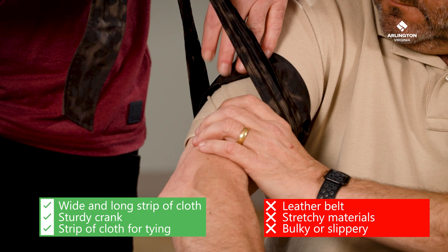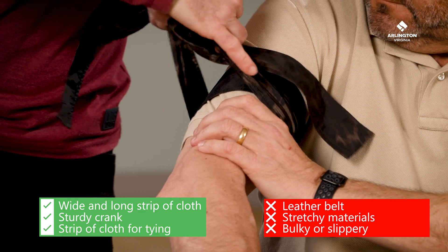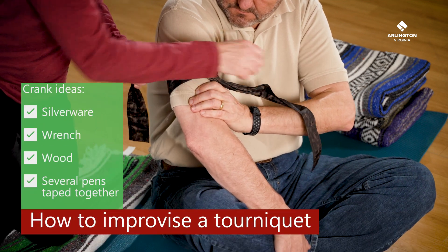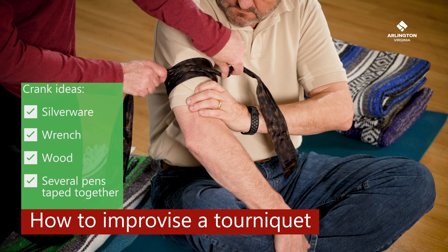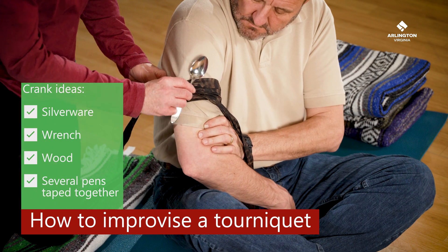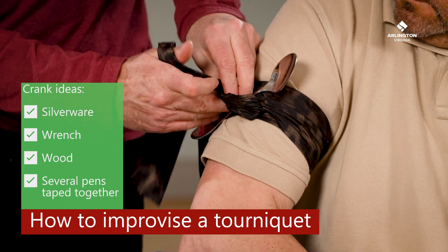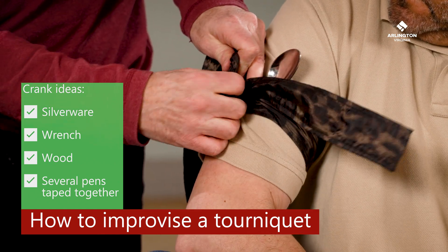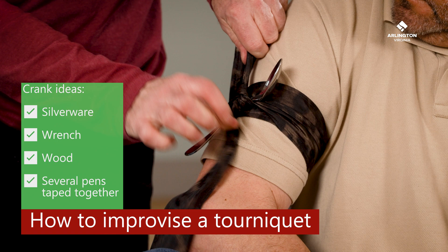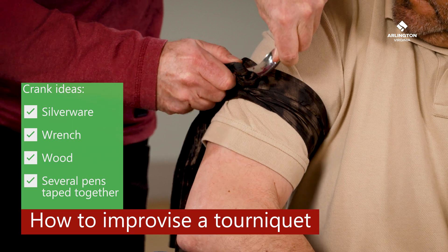People often want to use a leather belt, but it is not a good tourniquet strap because you can't twist it. Your strap will also be more effective if it's not too stretchy, bulky, or slippery. Start by draping the cloth from the top over the limb, then pull the ends around tightly and tie a knot — this creates a solid base to work on. As with the commercial tourniquet, it's most effective to make this very tight even before you start twisting. Then put the crank over the knot and tie another knot over the crank. Lift the crank up slightly as you twist to reduce pinching the skin, and turn until you can't turn it anymore.